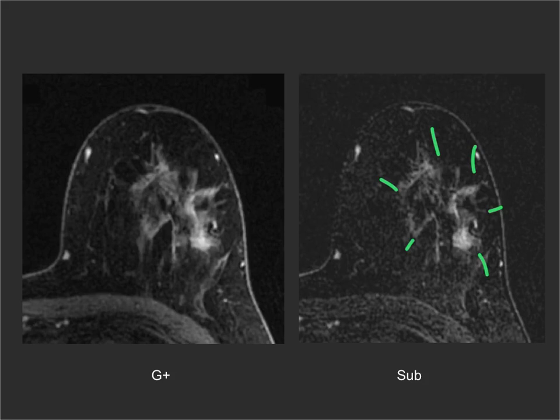All right, so I'm done here. I hope that's just a very brief overview of some of the common findings that you read on breast MRI, and will just help you a little bit in your breast MR interpretation.